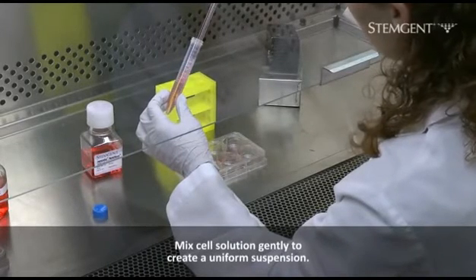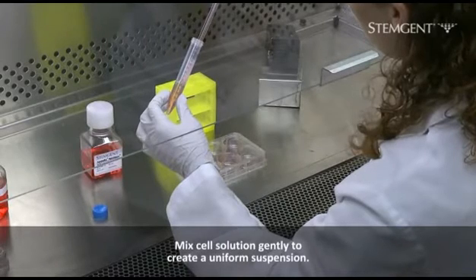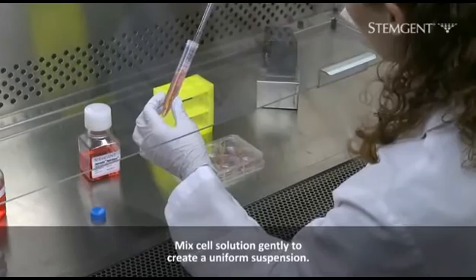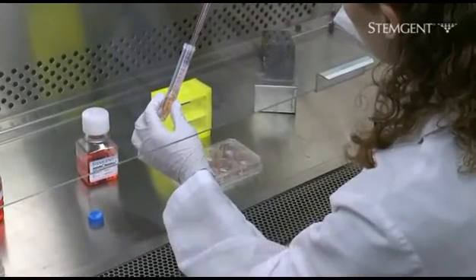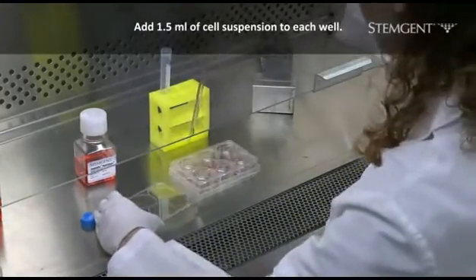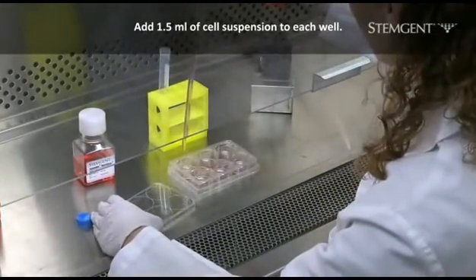Be sure not to over-pipet the cells. The cell pieces should be visible in suspension but not too large that they settle rapidly. Slowly add 1.5 milliliters of the cell suspension to each well of the new 6-well plate.